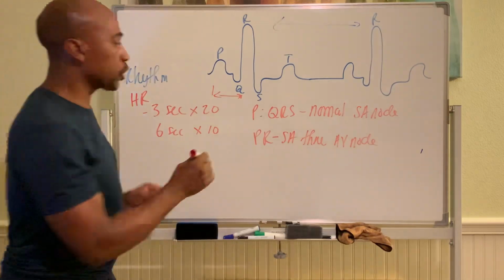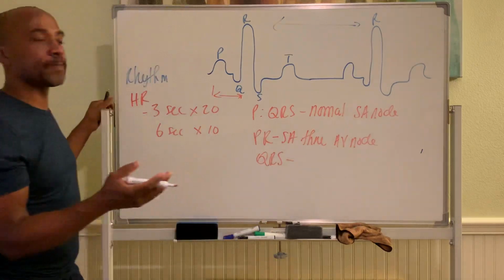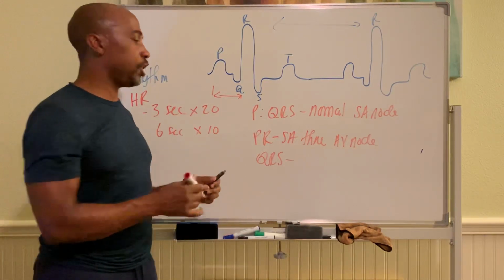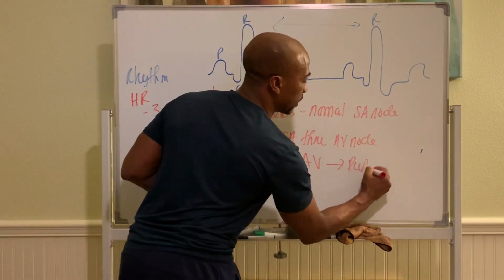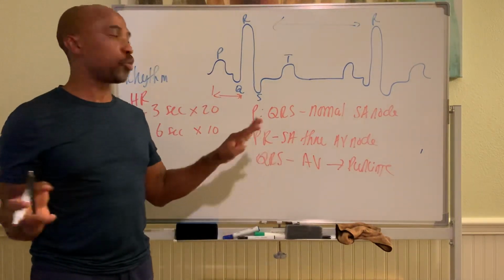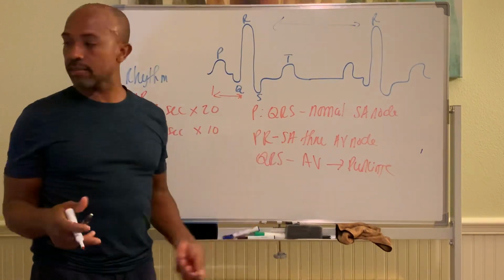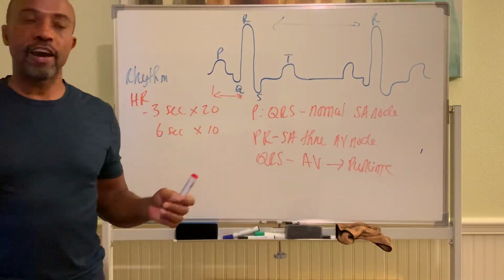And we also have your QRS interval. We asked for that as well. That one measures how much time it takes for the ventricles to become fully depolarized, meaning how long it takes to spread from the AV node through your Purkinje fibers. Again, in the lab, the table tells you what the normal times are. And so we want to see, when you measure these various things, are they within normal? And if not, you should discuss that. At least state that it's not within your typical 5 cardinal rules.